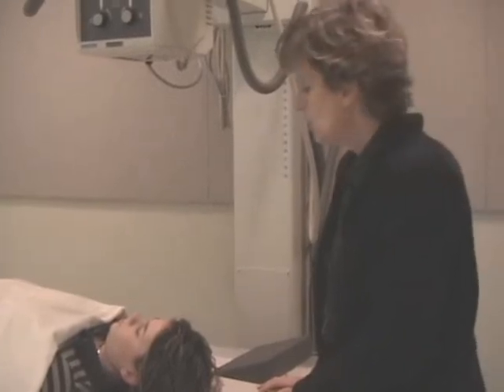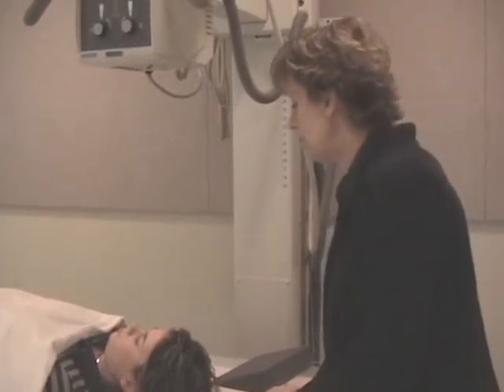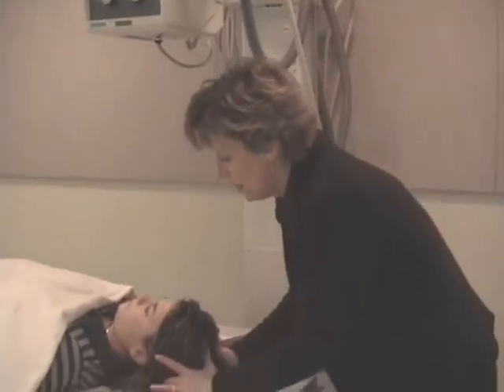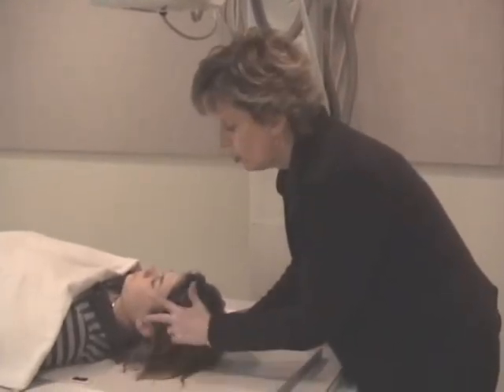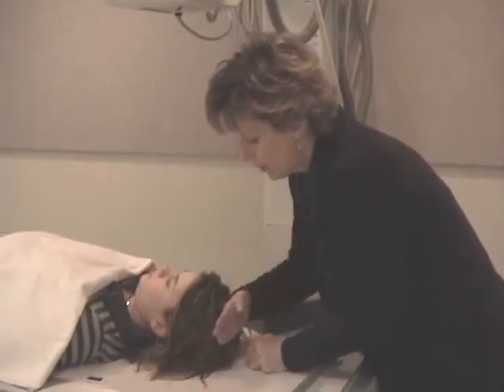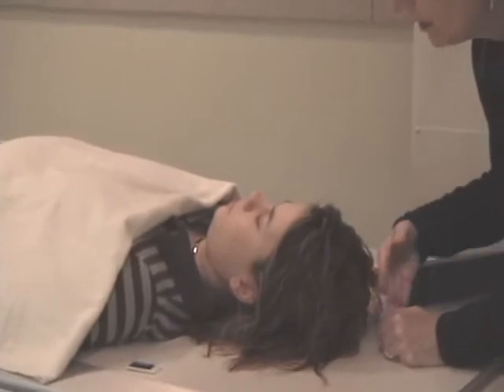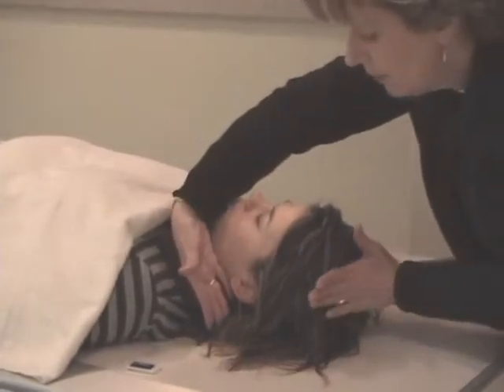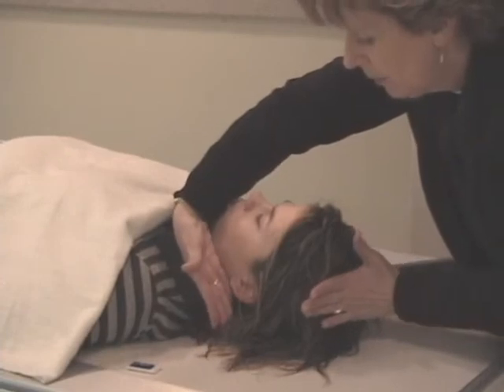Okay. We're almost done with the AP skull, so let me review again what we did. We had the patient tuck her chin in order to get the orbital meatal line perpendicular. I put the film's edge 2 inches above the vertex of her skull, but because I could palpate the edges, I found the mastoid tip and the vertex and centered that cranium.